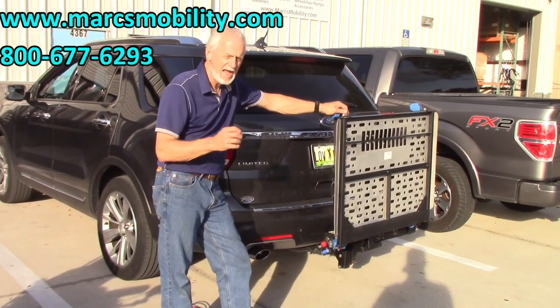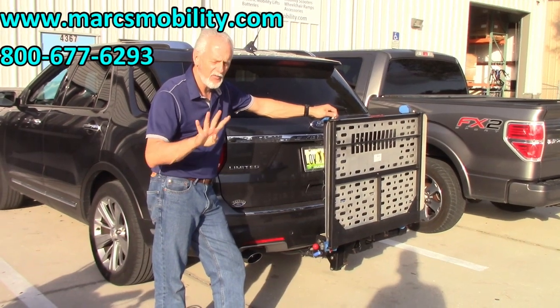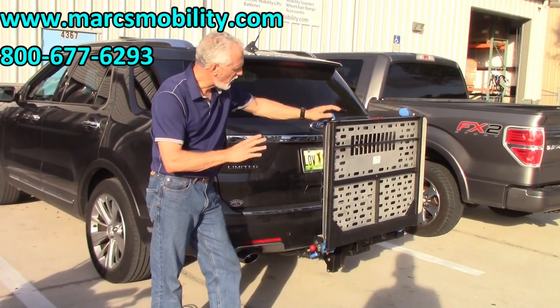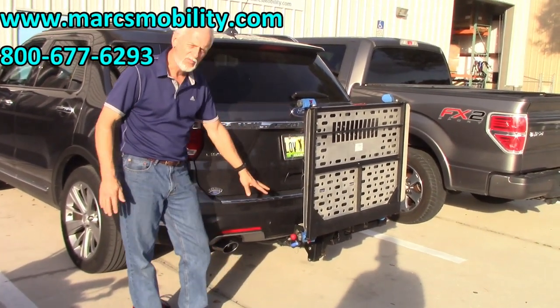This is the Harmar AL 500 HD. The HD stands for 400-pound lifting capability. This is a platform with four straps with the 400-pound lifting capability, and it does have the swing-away.